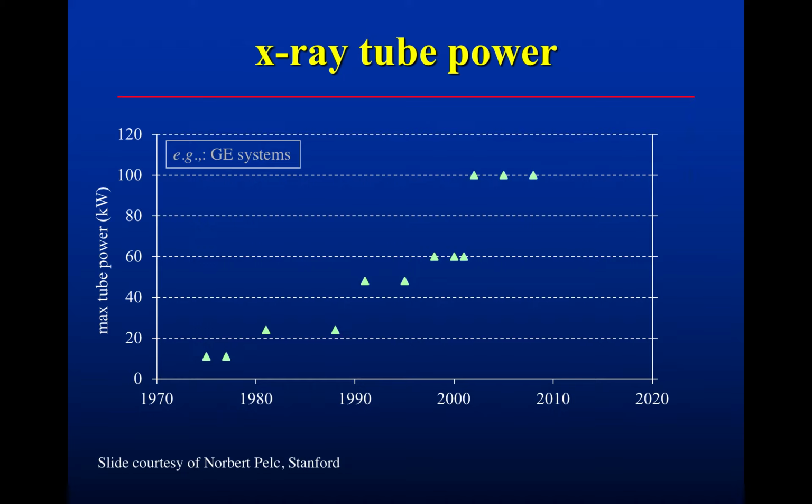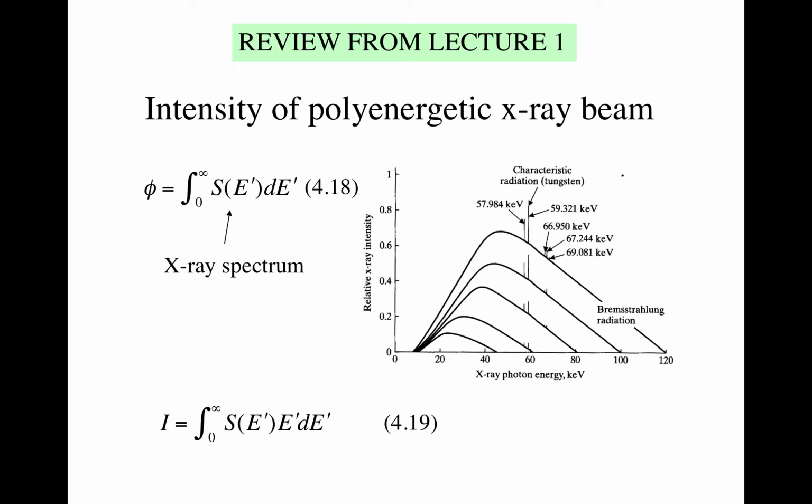Now take 1,000 of them, and then put a big lens over top of you and turn them on. That's the kind of energy that's coming down here, and it's all done in a very short period of time. So it's a lot of power, and they're becoming more powerful because we want to image in shorter and shorter amounts of time.